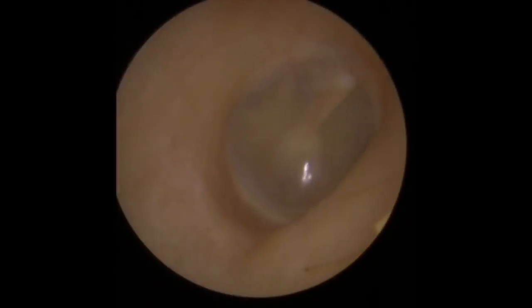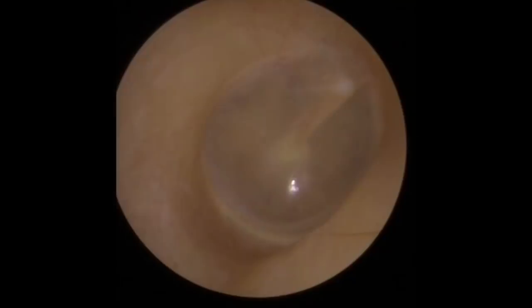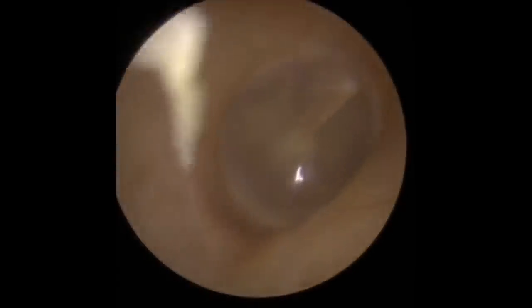Hi everybody, this is Rhys Barber from Audiology Associates. So what you can see here is this patient has no wax in this ear canal. This is the eardrum. So I thought I'd point out a couple of things that we look at on the eardrum. So the first thing we're going to see is we've got a nice light reflex at the bottom of the eardrum here, and the hammer bone there, which is the top I was pointing to. The skin itself is nice and smooth and pearlescent. So I thought we'd have a bit of fun with this one.